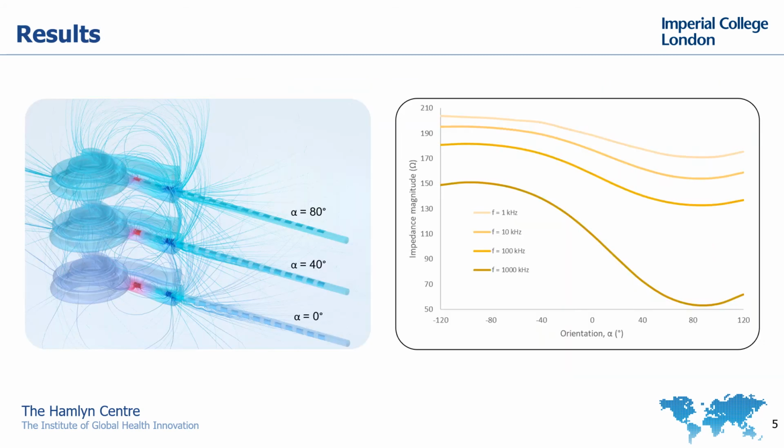As it can be seen in the picture on the left, in our simulation we consider an angle of 0 degrees when the implant is facing the inner wall, and we count angles clockwise. Our results can be seen in the picture on the right.